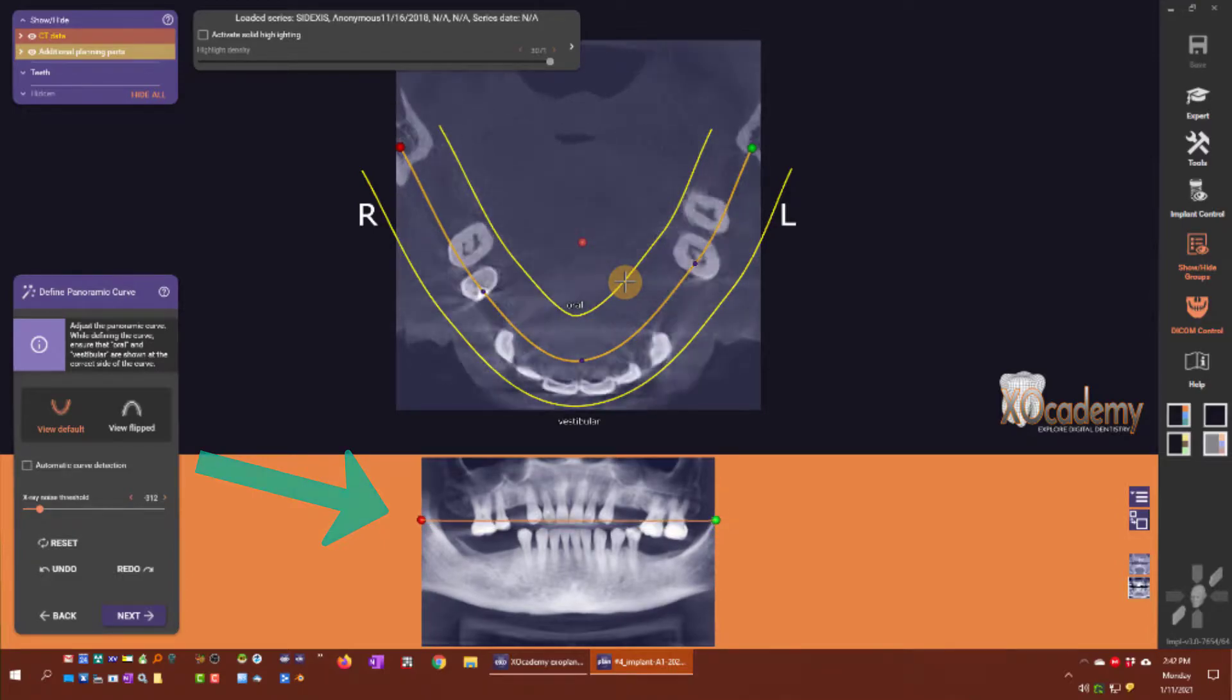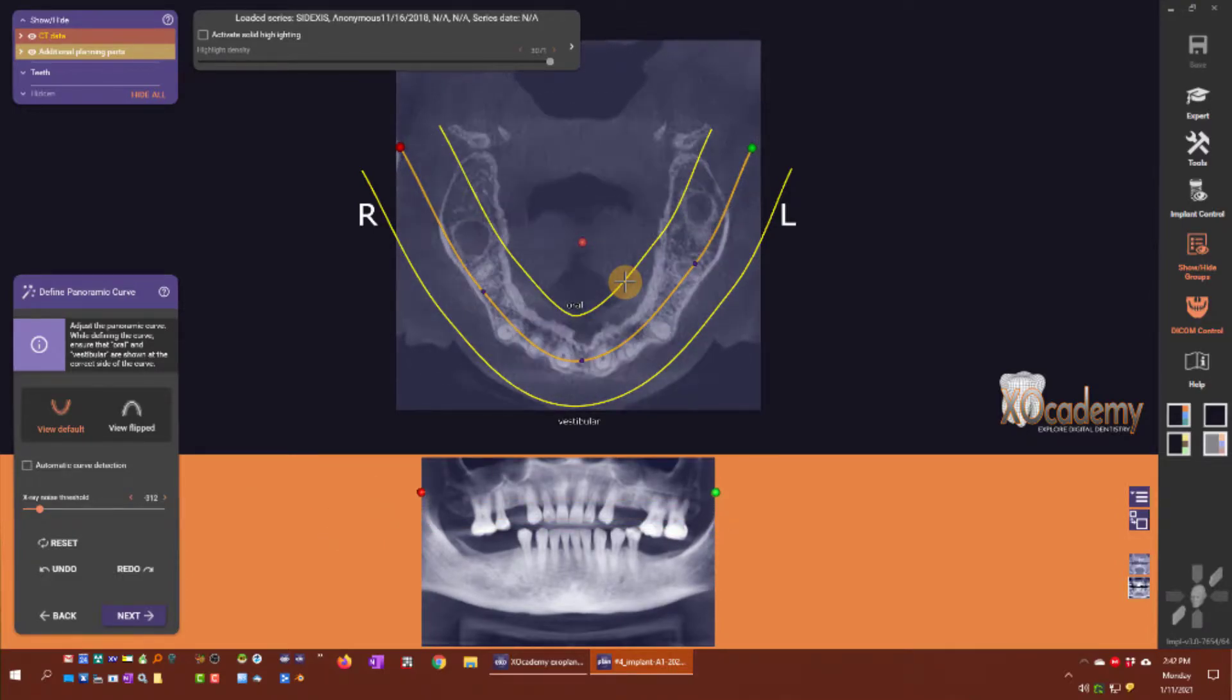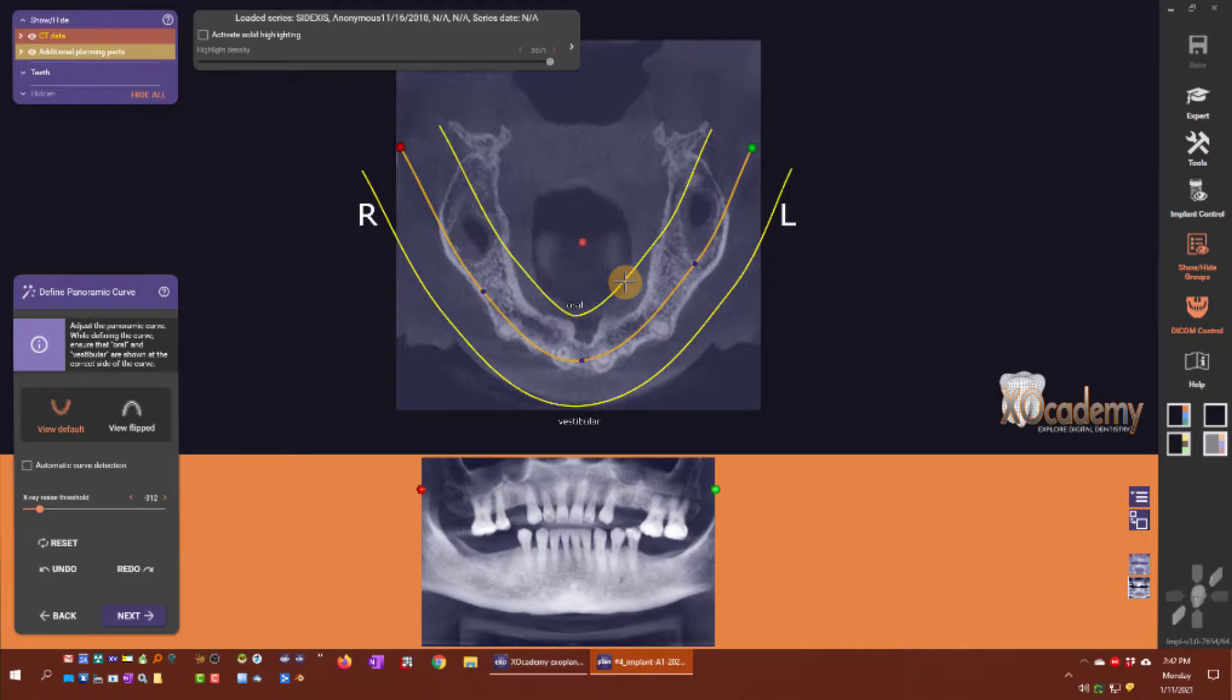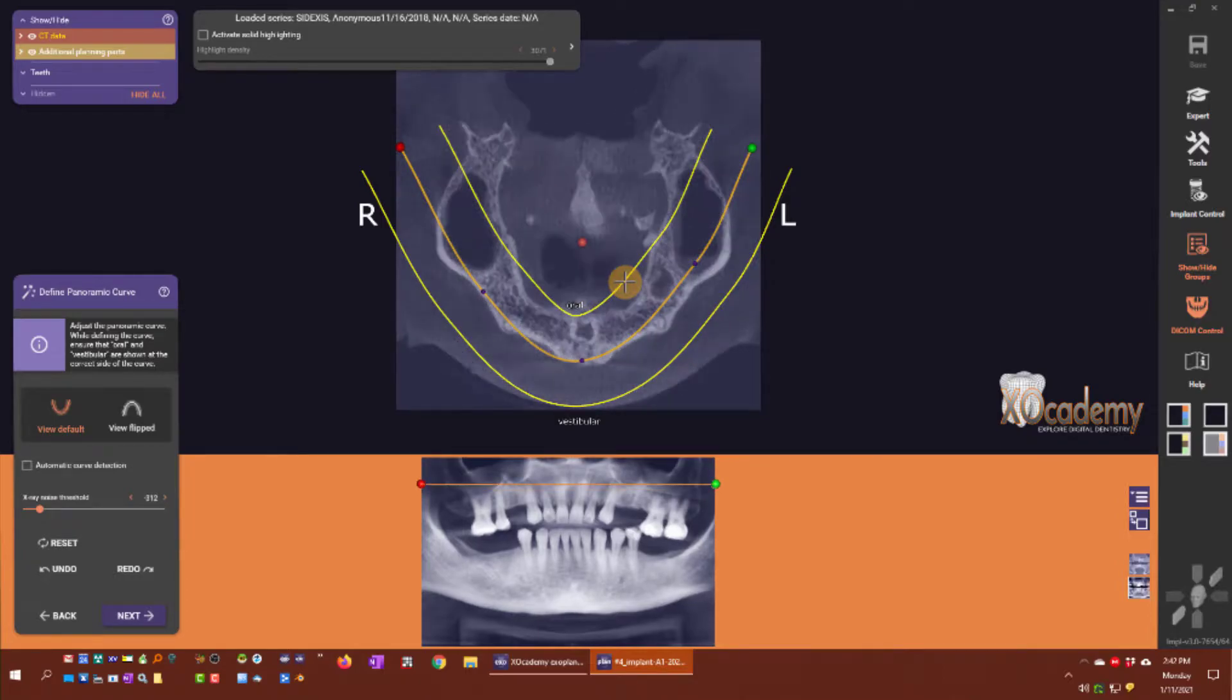I'm scrolling up and now you see it's in the lower extent of the maxillary sinuses.